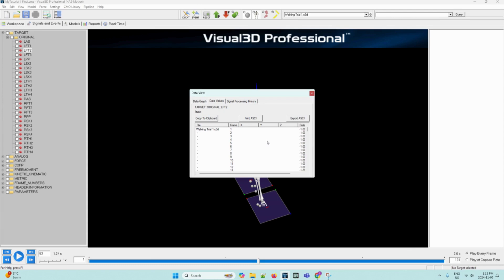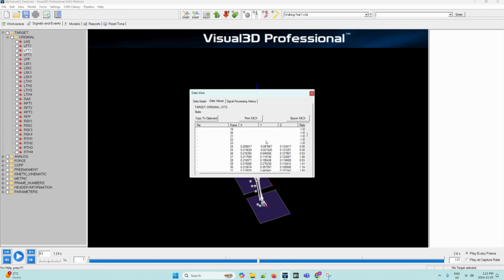Here you can see the raw data or an option to export it to an ASCII file. On the data values tab, scroll down to the 24th frame. This is where the data capture in the system began to collect data for this segment. No data was recorded for this segment in the previous 23 frames. This is not abnormal, but it is good to be aware that some markers will not have data for every frame. The reasons for this vary, but in this particular case, the left foot was not in view of the cameras until the 24th frame.